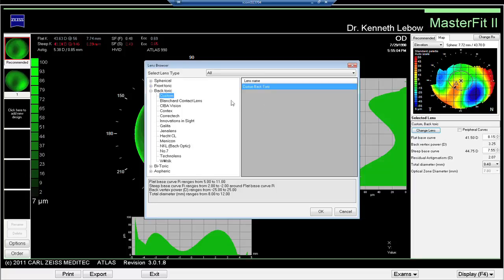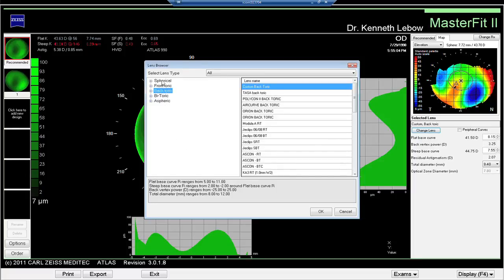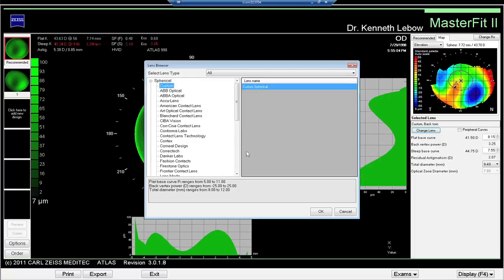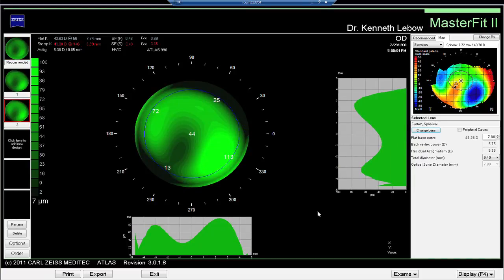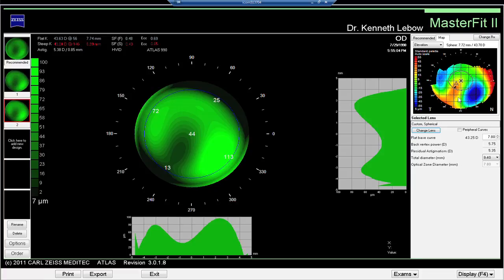Instead of a back toric lens, let's look at a custom spherical lens. The suggested curvature shows green representing lots of pooling — the tear film depth is as much as 113 microns in some areas and only 13 microns in another. So we don't have a very uniform basis for a contact lens fit. However, looking at the elevation map, this contact lens fluorescein pattern literally matches the elevation map.